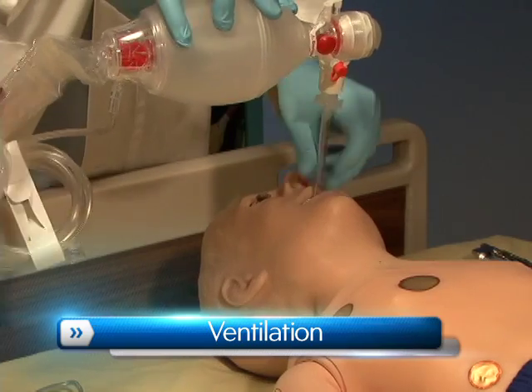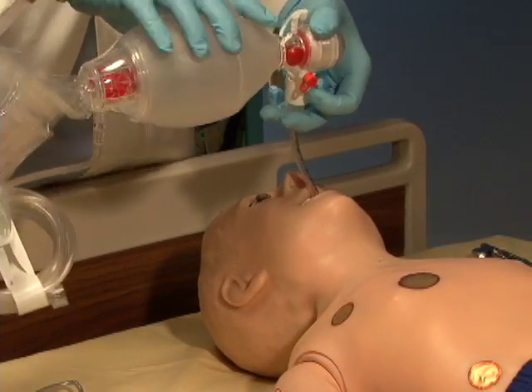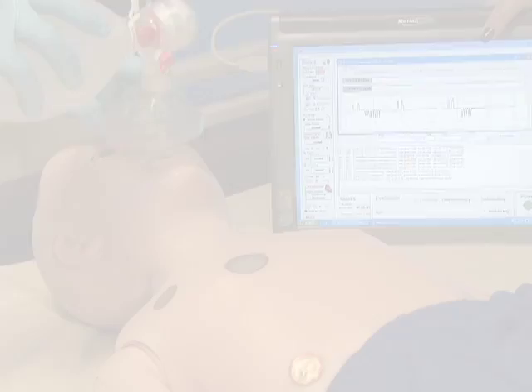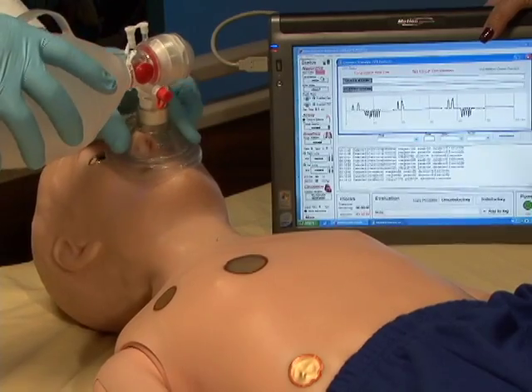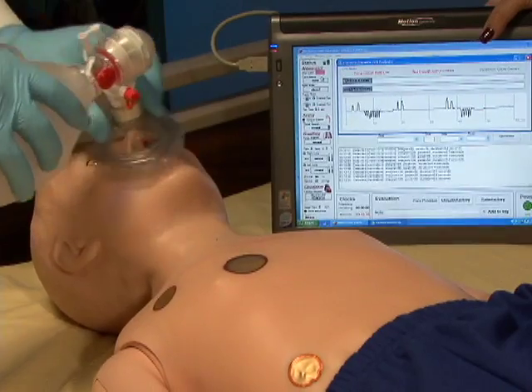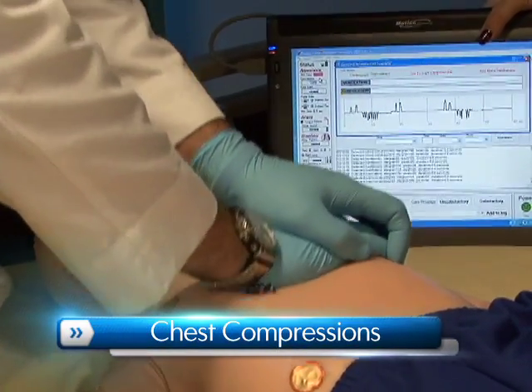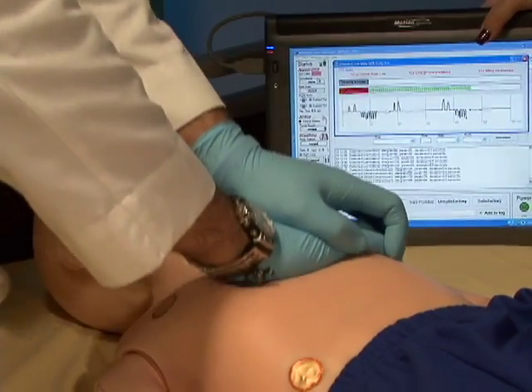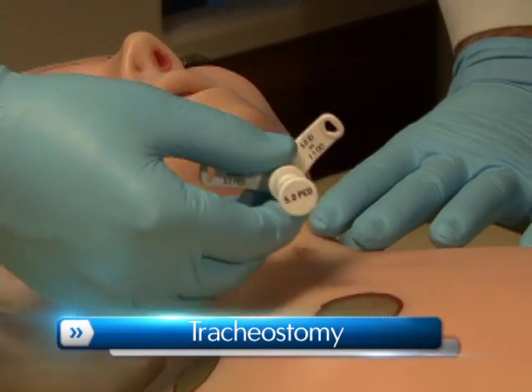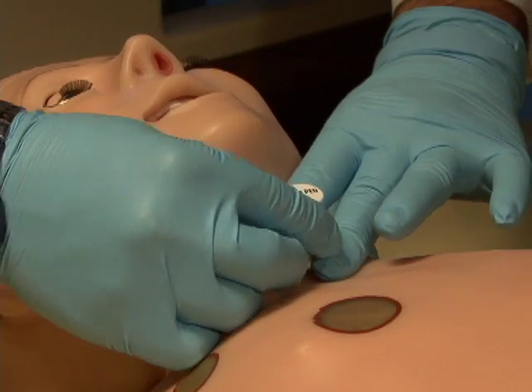Additionally, pediatric HAL can be ventilated with a BVM or mechanical ventilator. Ventilation and manual chest compressions are measured and logged, showing the instructor exactly how students are performing. Users can also perform a tracheostomy procedure during a difficult airway scenario.